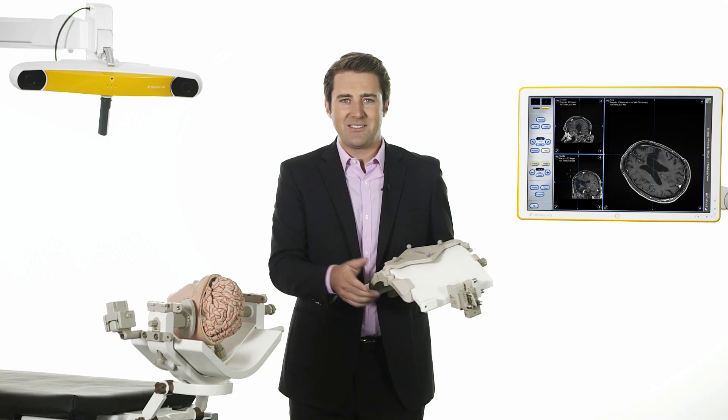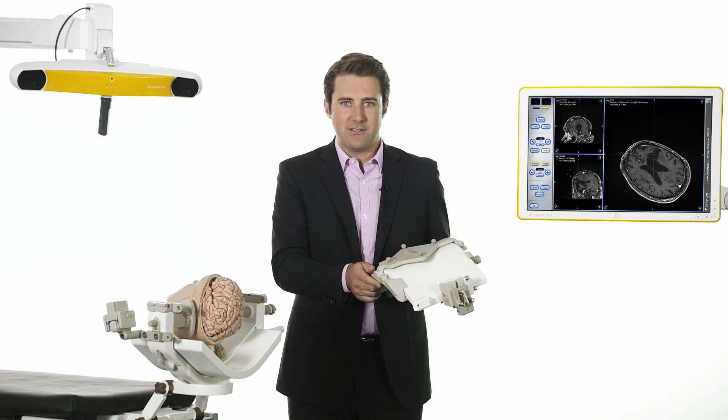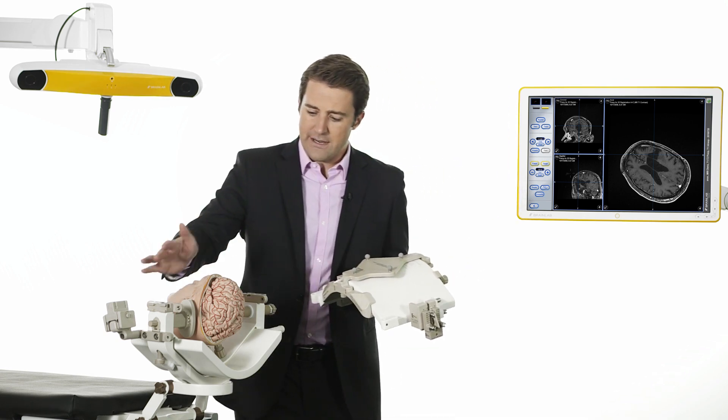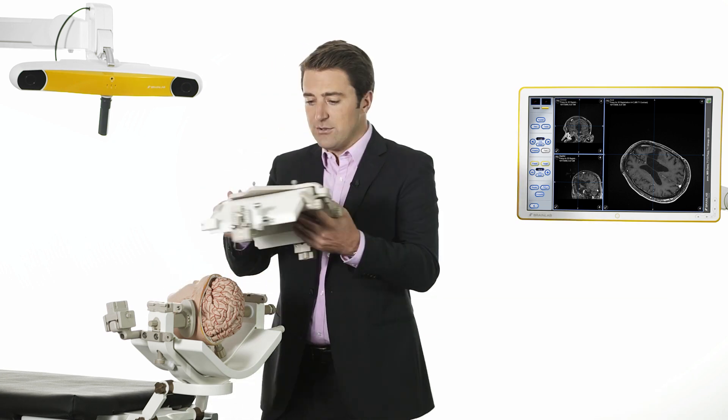To update anatomical data during the procedure in order to assess brain shift or for resection control, the surgical field is draped and the top coil is mounted to the headholder.